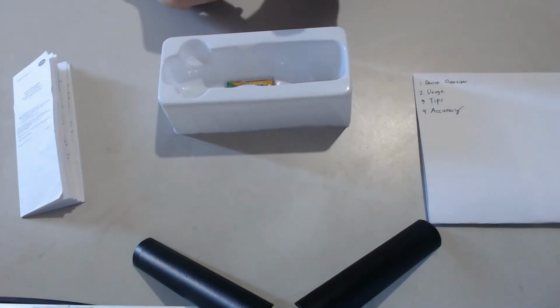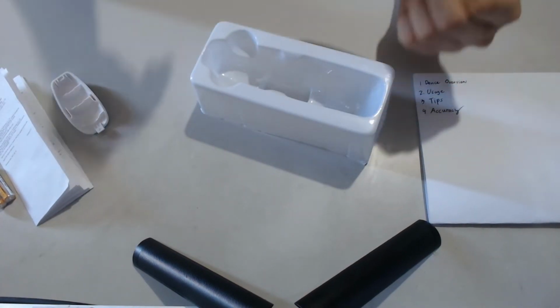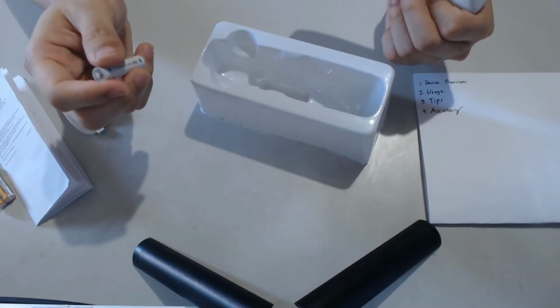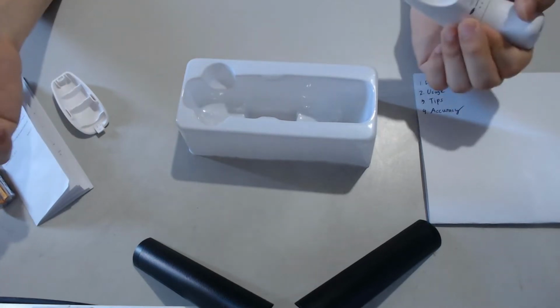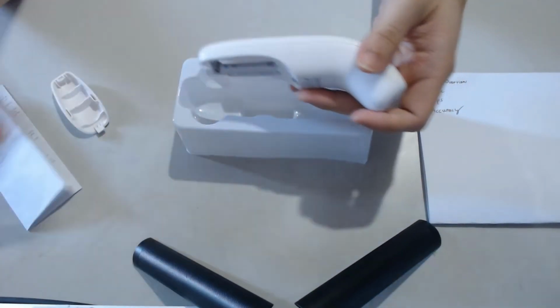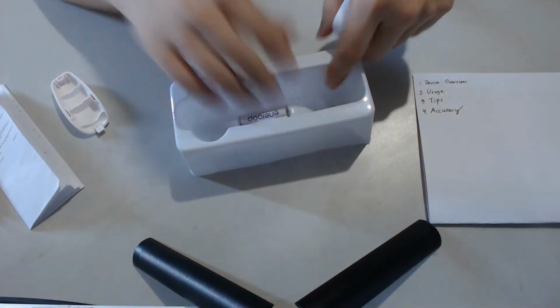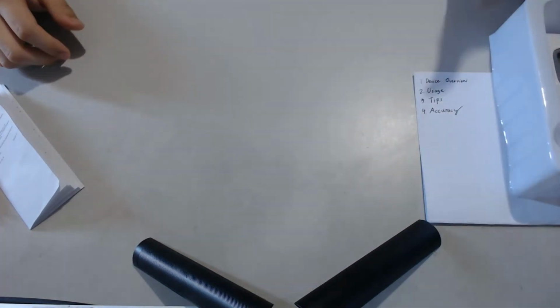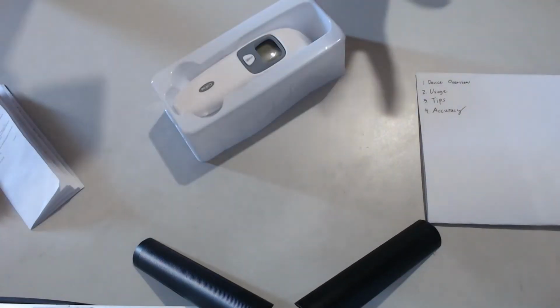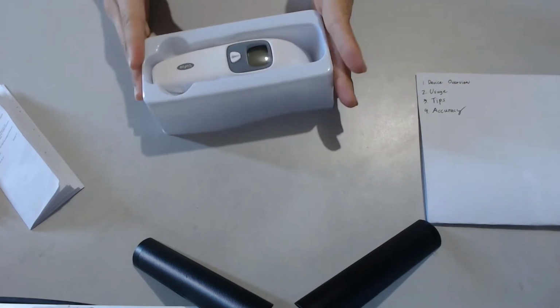As a plus side, if you're using alkaline batteries, this compartment doubles as storage. If you're a normal household, you don't get a fever every day. At most, a member of your household will catch a fever once or twice a year, and in between you don't really use this device. If you keep the battery inside, it will leak. So this one has a compartment to store the batteries. See? Then you can just put it here and store it somewhere. If you want to keep the box, go ahead, but at the very least, keep this. This is a very good carrying compartment or stand for this thermometer. That's tip number one.